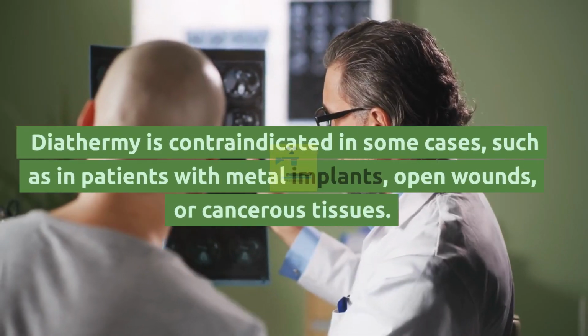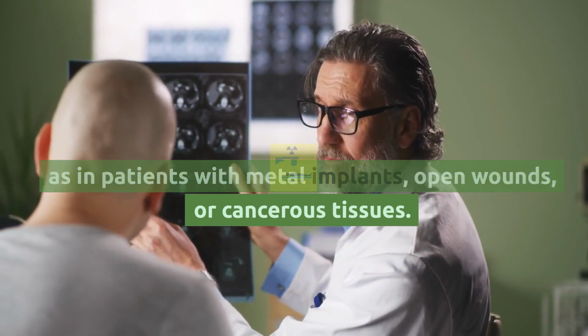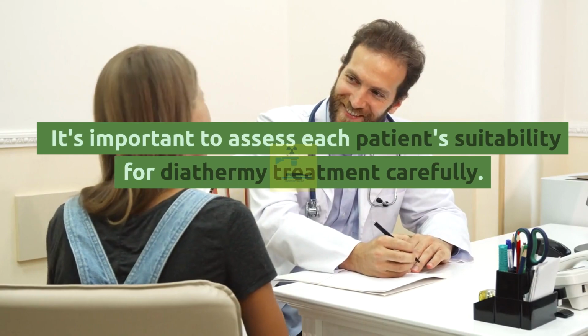Contraindications. Diathermy is contraindicated in some cases, such as in patients with metal implants, open wounds, or cancerous tissues. It's important to assess each patient's suitability for diathermy treatment carefully.